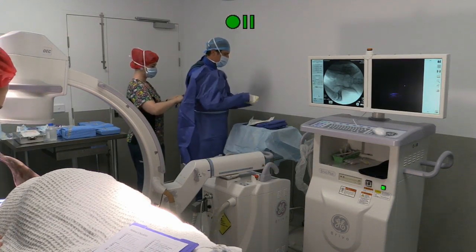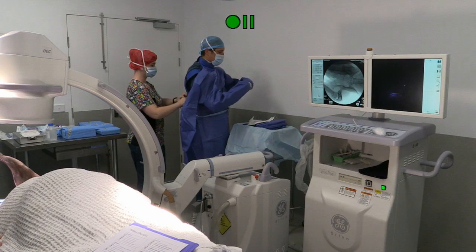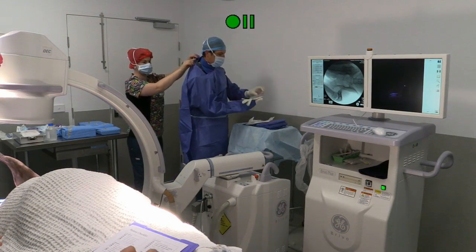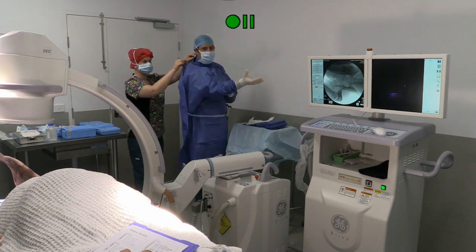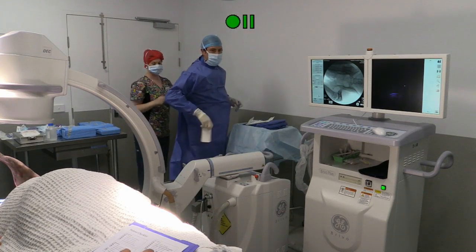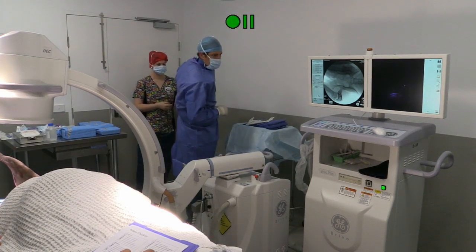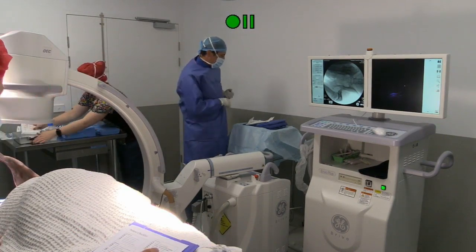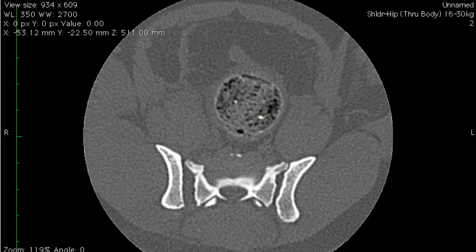Review plan, operative team. So, first off guidance, review SI luxation, and then prepare for the screw. I'm not sure, I'm probably going to just use a 3.5 screw, but I might try to use a headless compression screw. Okay, let me know. I'll hold off on opening any of that until you're ready. Confirm instruments, you were just saying. Did you want photos taken? No. Lovely. And potential complications.